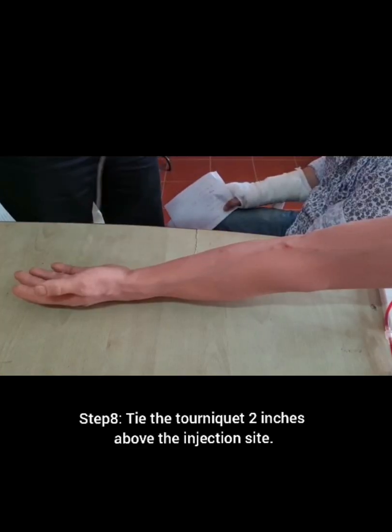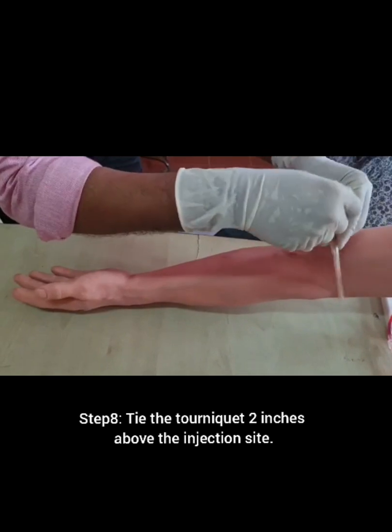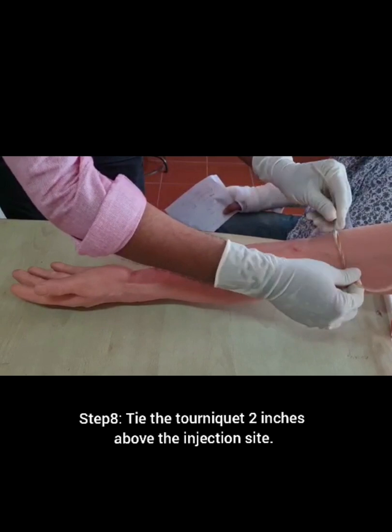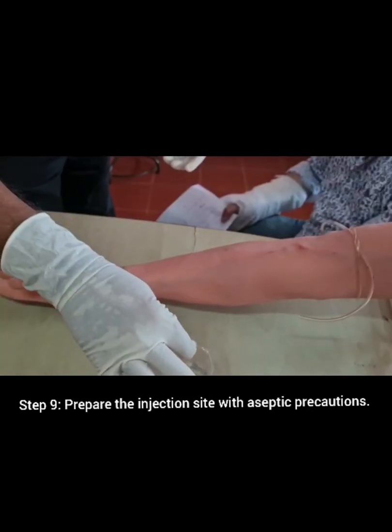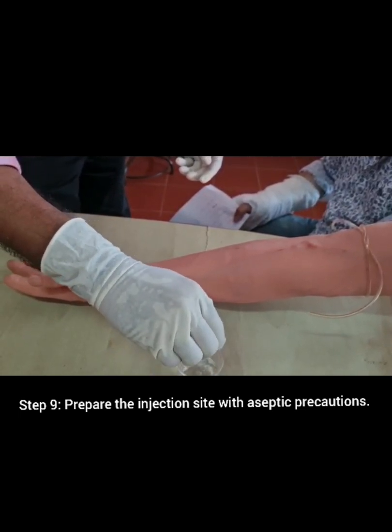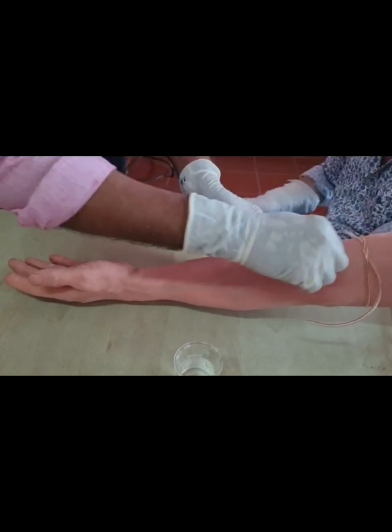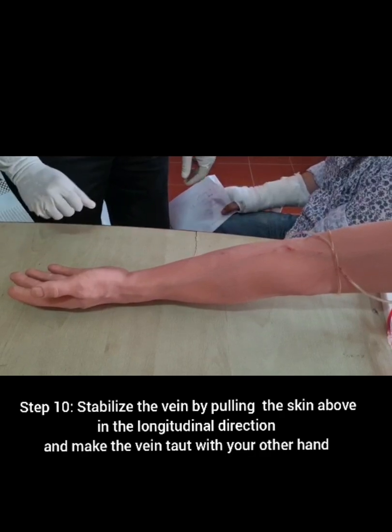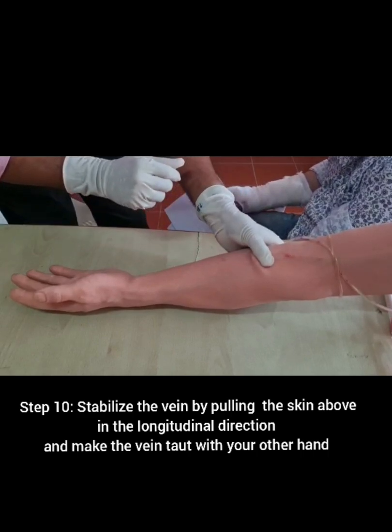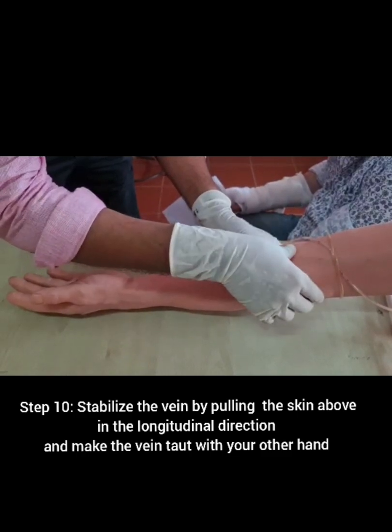Tie the tourniquet two inches above the puncture site. Prepare the injection site with aseptic precautions. Stabilize the vein by pulling the skin above in the longitudinal direction, and make the vein taut with your other hand.